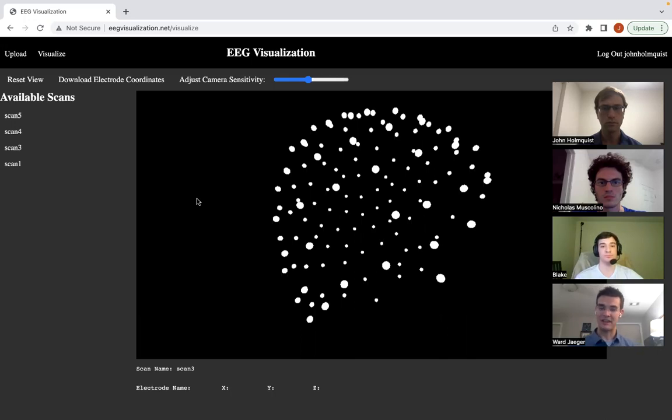Lastly, we perform a DBSCAN clustering algorithm, which segments our data into different clusters, which each represent an electrode. We can find the centroids of these clusters and export those and save them to our database and render them as you see on the screen here.